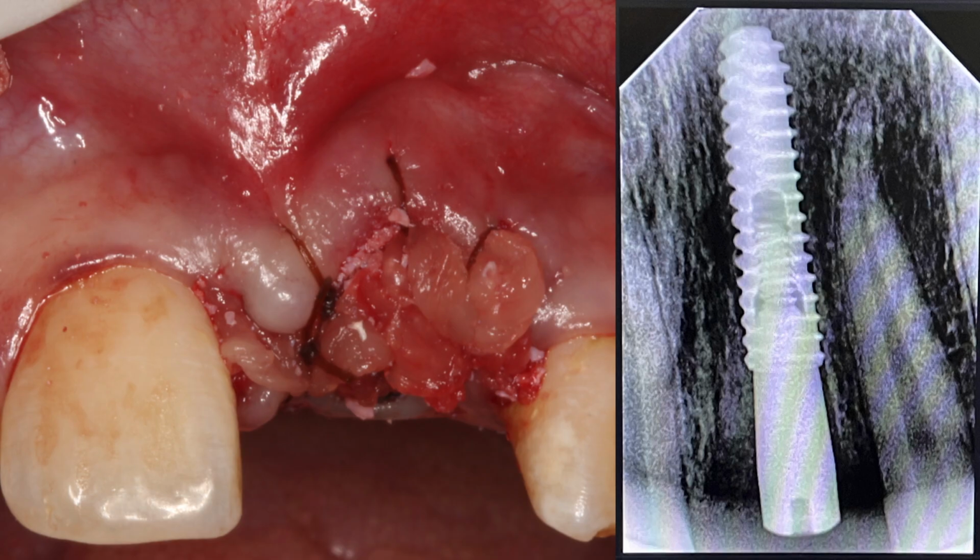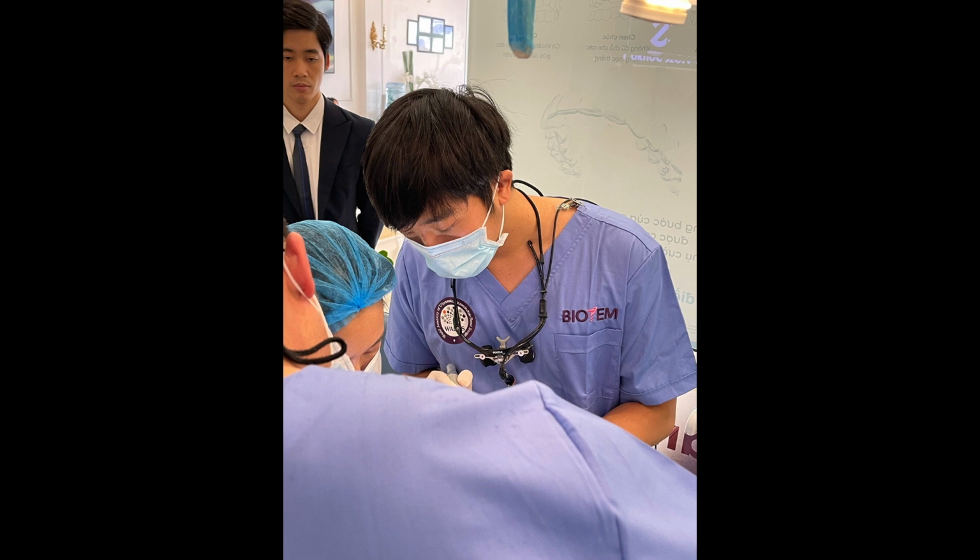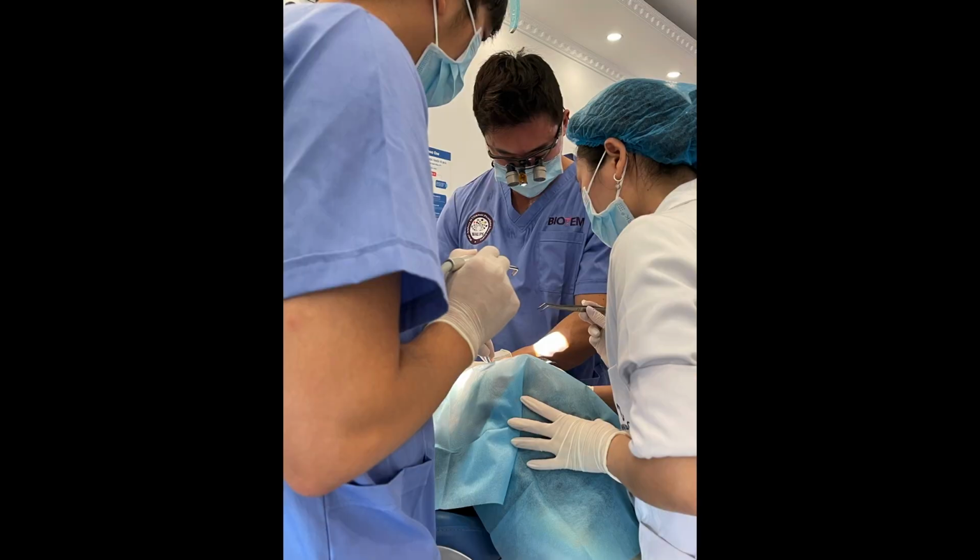Here is the post-op PA showing the depth of the implant placement, which I think is appropriate, and eventually when we have a nice emergence profile, we should be able to get a very successful restoration with nice papilla retention and gingival form. So I hope that local partners should be able to complete this case with nice aesthetic result in a few months. This was a great case done by Dr. Tommy Park and his partner Jay Park.